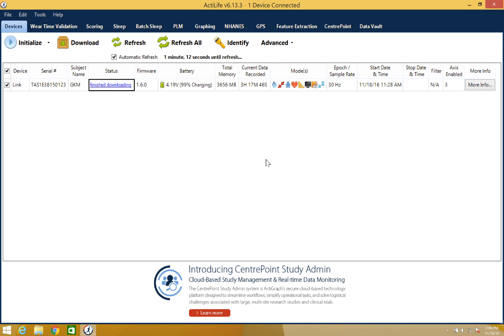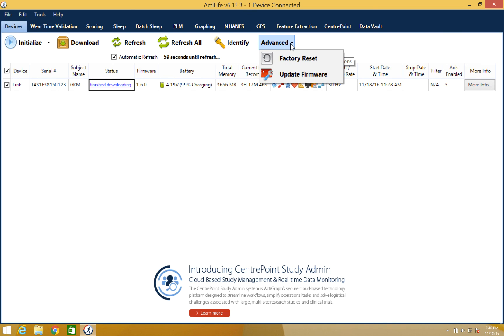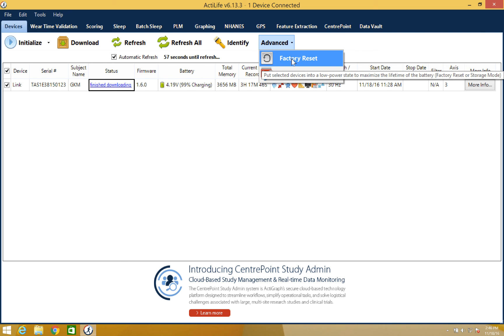Note that after the download is complete, data will remain on the device until it is reinitialized. If you plan to store the device for an extended period of time, you can perform a factory reset by selecting the advanced option and then factory reset. This will erase the data and put the battery into a low power state for storage.